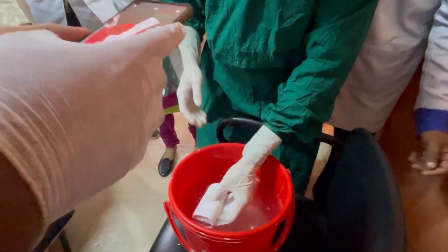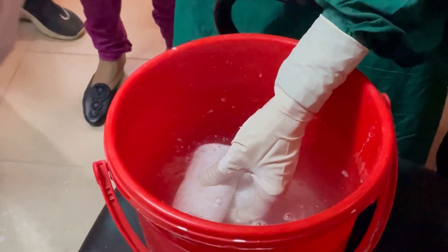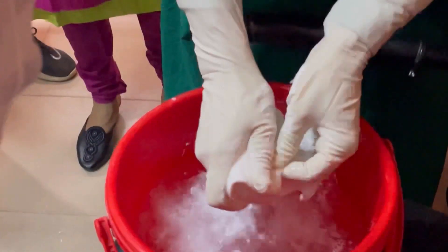The plaster bandage is dipped into the water. The bandage is held in the water until any bubbling subsides. The excess water is removed by gently squeezing the ends on both sides.